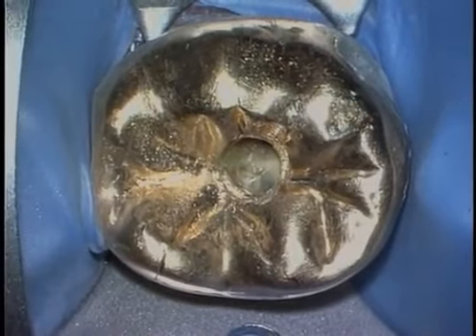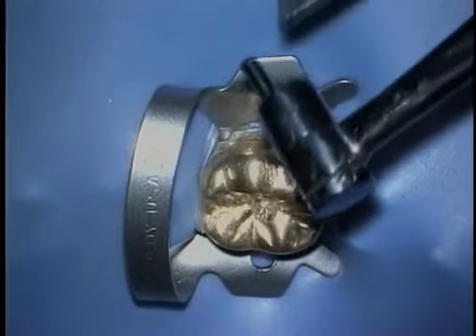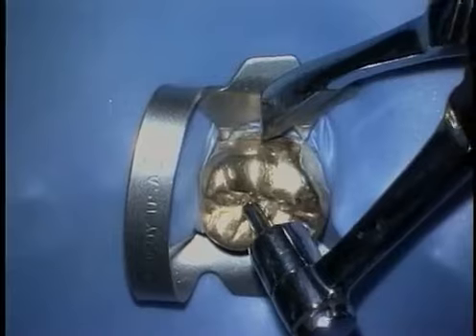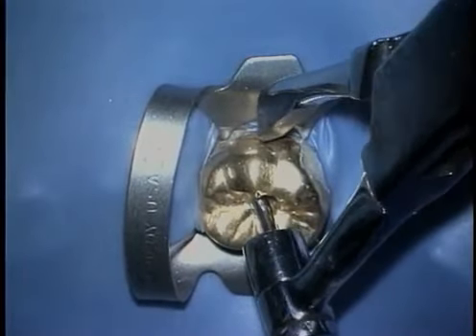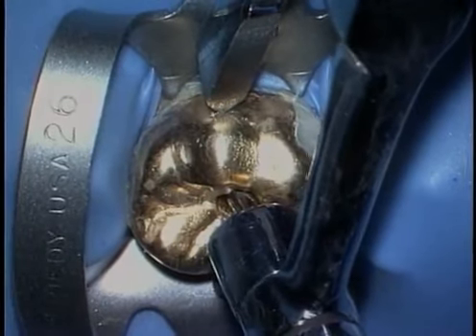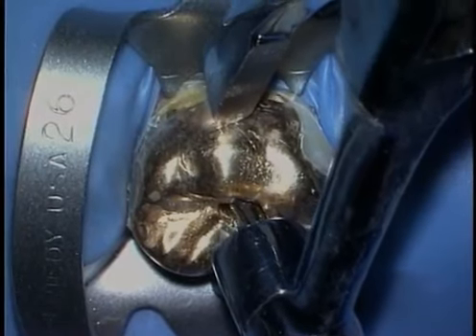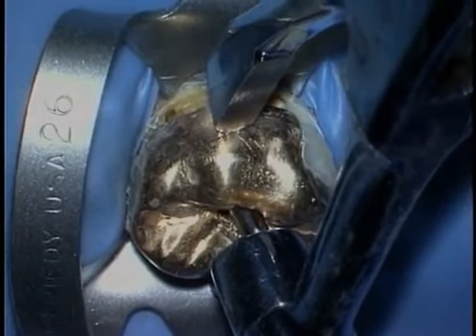The swivel pin is inserted through the hole in the crown so that the removal forces are directed down the long axis of the tooth. To ensure a stable and strong grip, place the removal tip below the height of contour. Gently squeezing the handles of the Klein plier will generate sufficient opposing pressure and typically will lift the restoration off the tooth.